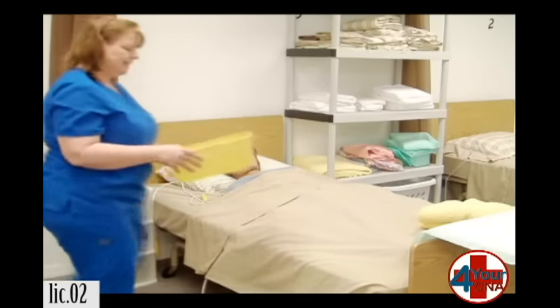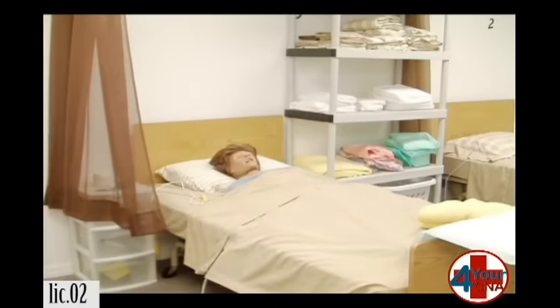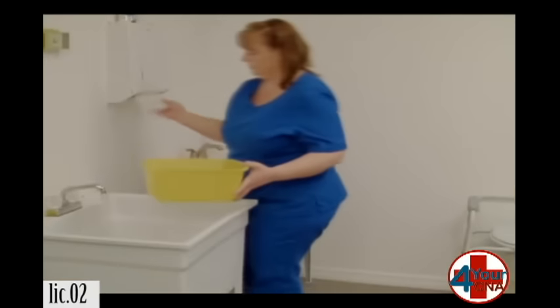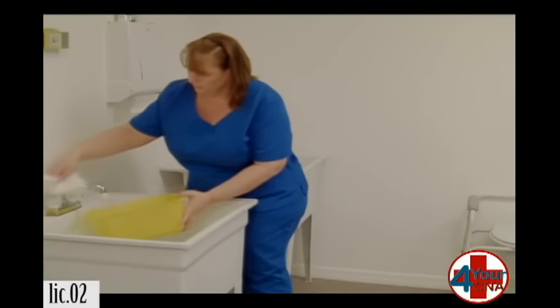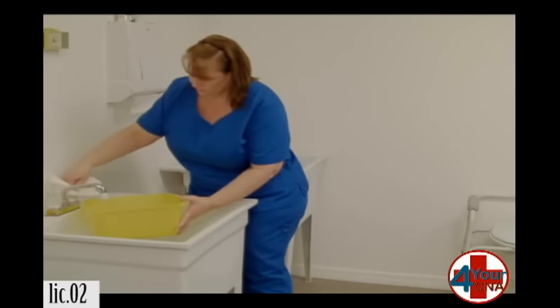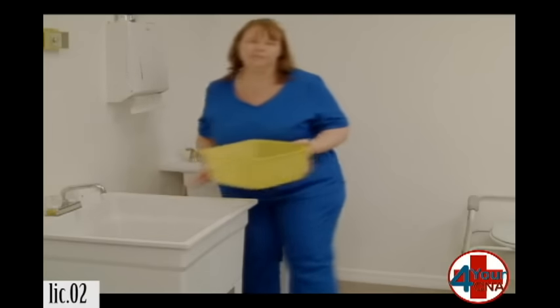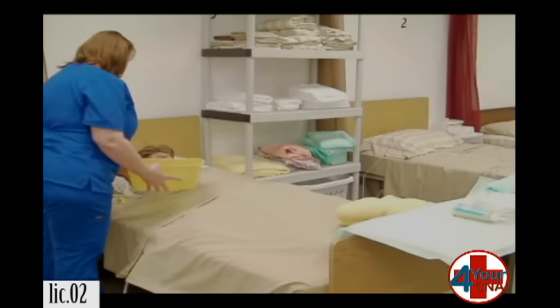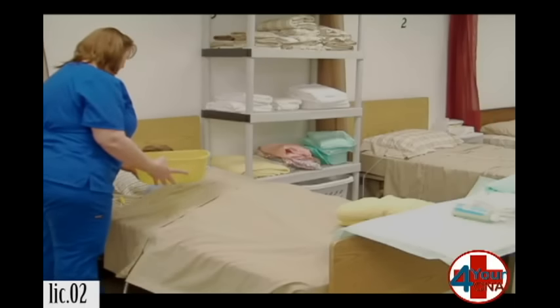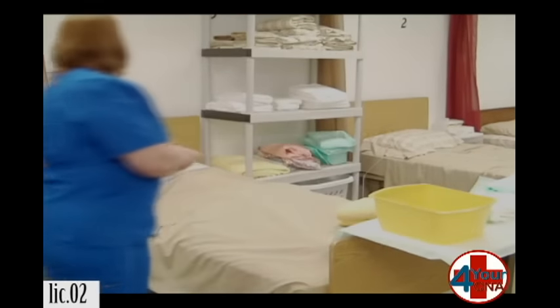I need a basin and soap. Let me get some water in the basin. I'll be right back. Ms. Jones, would you like to check the water temperature and make sure it's okay? It's good. Wonderful. Let me grab a pair of gloves and I'll be right with you.